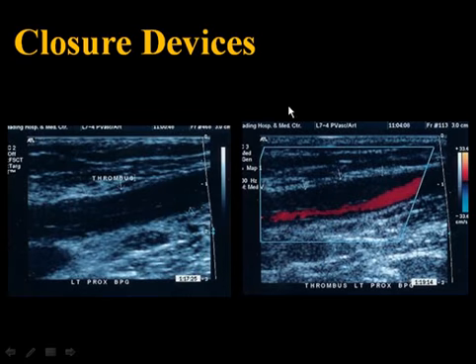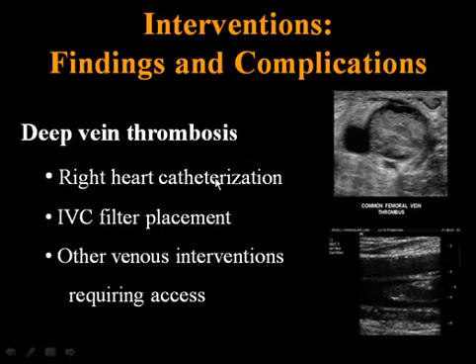We have experienced complications in these patients. You can see here thrombus by the 2D image forming around the closure device, and then the color flow image really just confirming the suspicion of the 2D image. You can see that the lumen has been significantly narrowed in this patient.